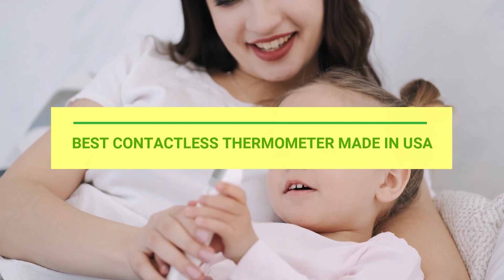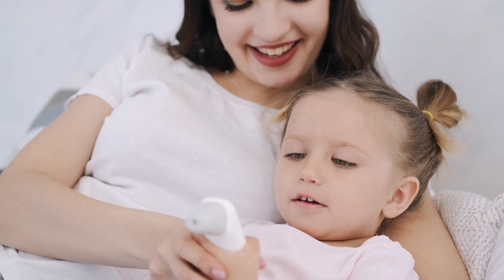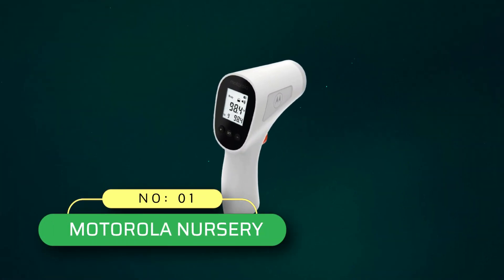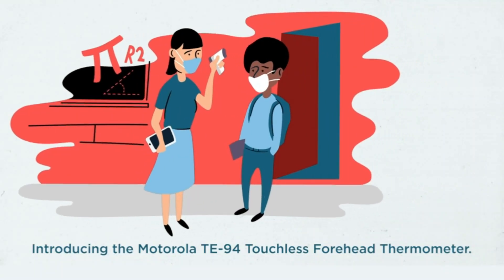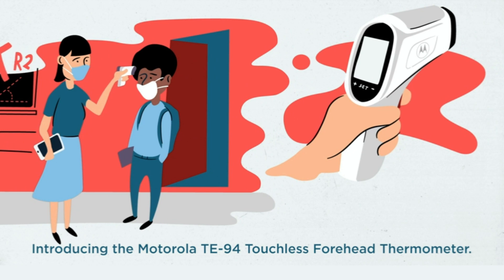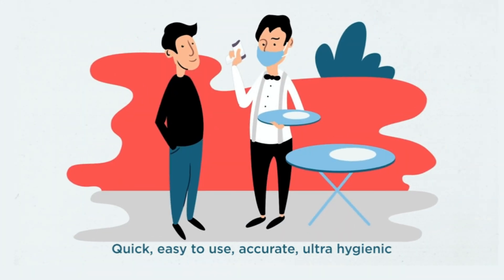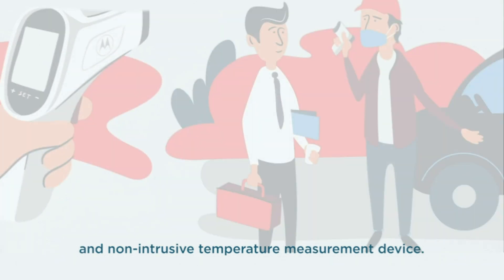Best contactless thermometer made in USA. Number 1: Motorola Nursery contactless thermometer made in USA. The TE94 touchless forehead thermometer is quick and easy to use, providing an accurate and non-intrusive temperature measurement every time. This infrared thermometer is ideal for the whole family.